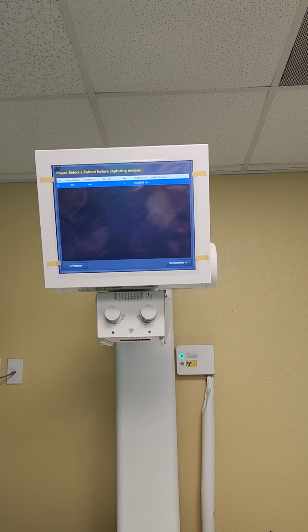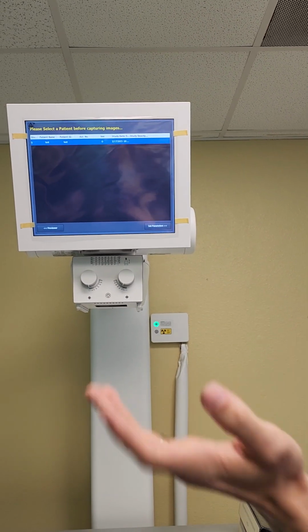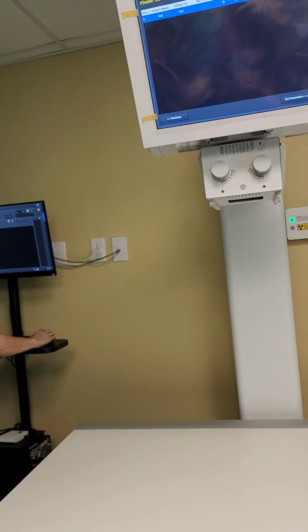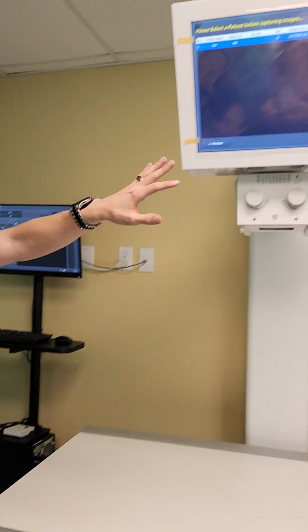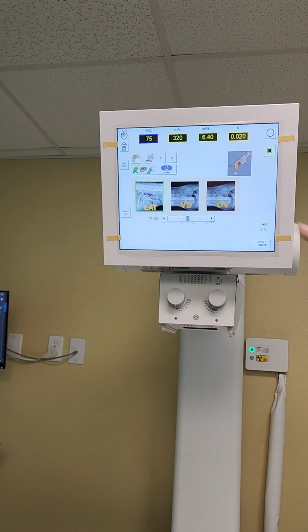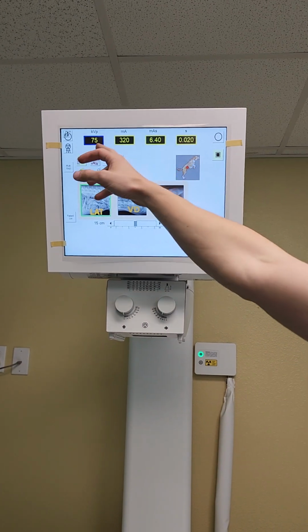This is just where you select your patient. So if you had multiple patients lined up, you can select which ones. Normally it just populates with this one. You can select which techniques you want to use over there, and you can go in order, just 1, 2, 3, click, click, click. For example, let's do an abdomen here, and then set parameters, and it brought up our abdomen that we're going to shoot. You still want to measure, but it automatically populates the techniques.